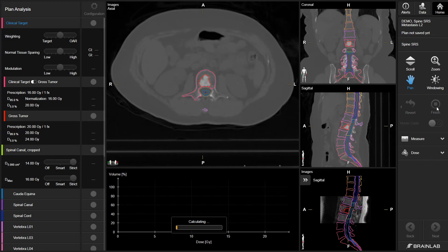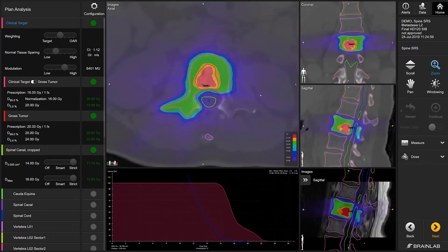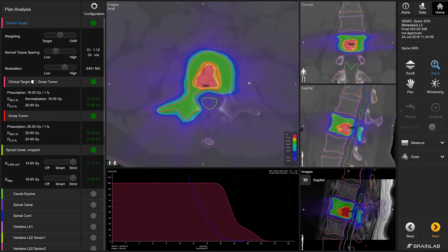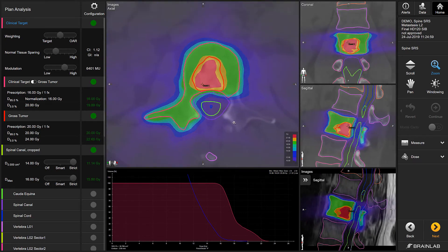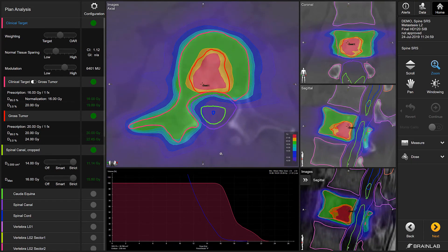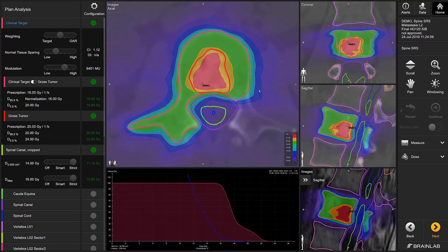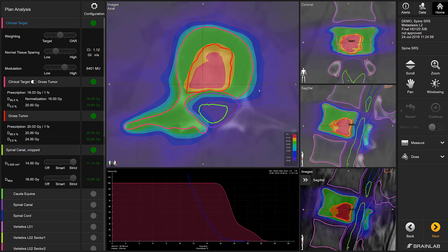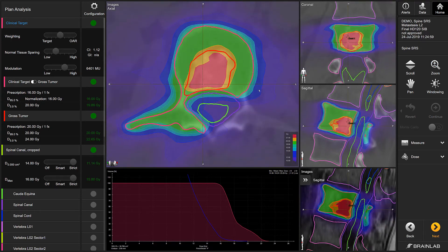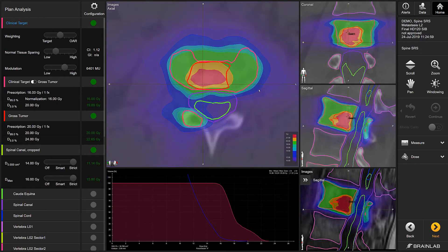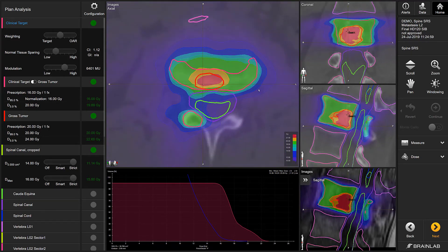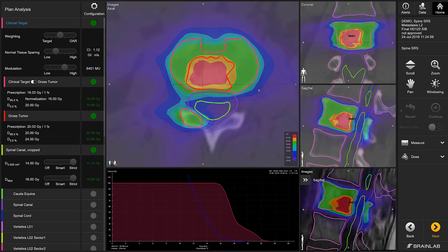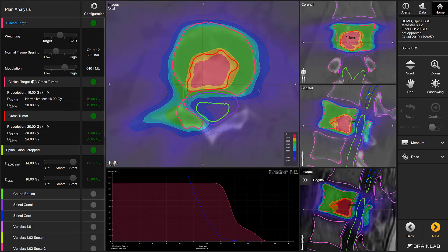With just one click, a Spine VMAT plan is created in minutes. Among a number of various optimization techniques, a patented algorithm selectively exposes the vertebra for enhanced spinal cord sparing. Based on the Monte Carlo approach, treatment planning already includes the high-precision algorithm during optimization, not just for the final calculation.